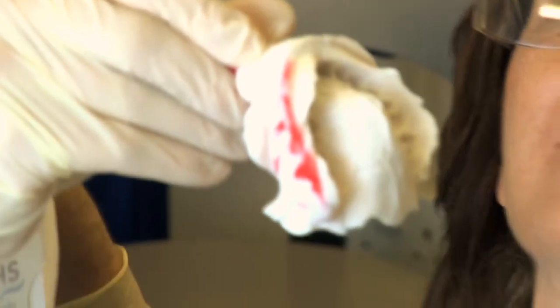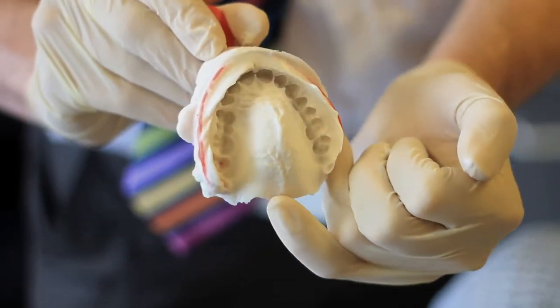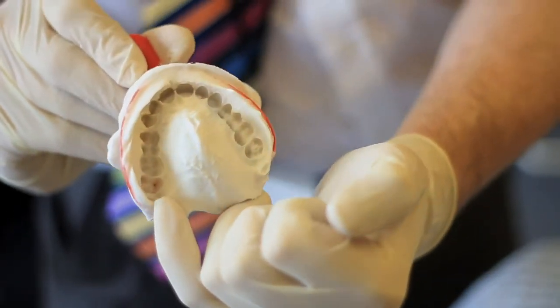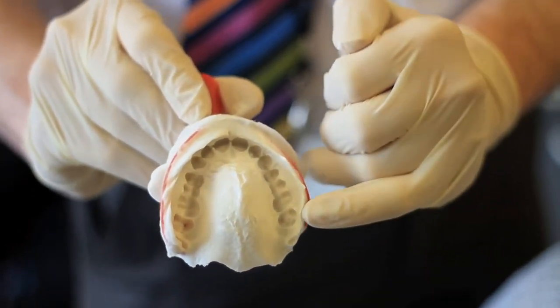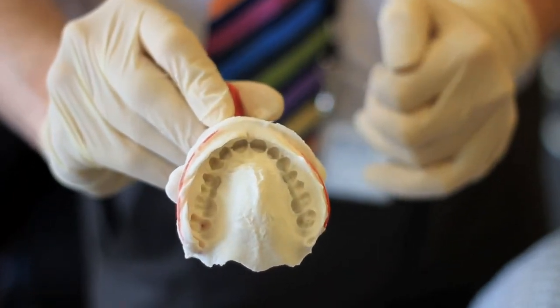There we go. So this time we've not got a very good impression because there's too much material over the back of the palate going down the patient's throat. There'll be quite a big air blow just at the rear and the upper left molar region, and we've got very poor definition of the labial and buccal sulci.